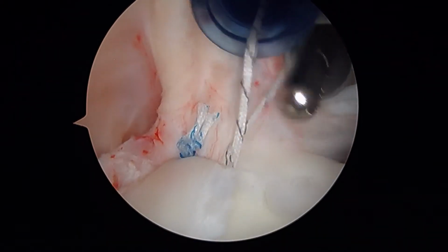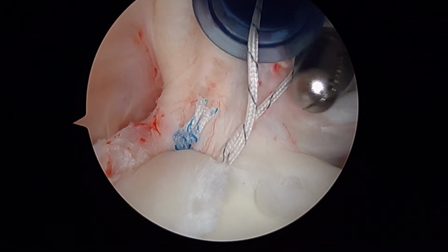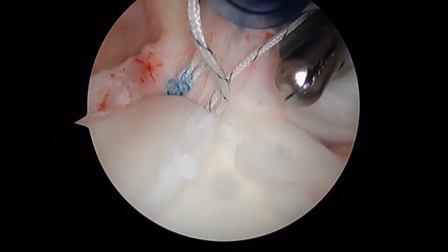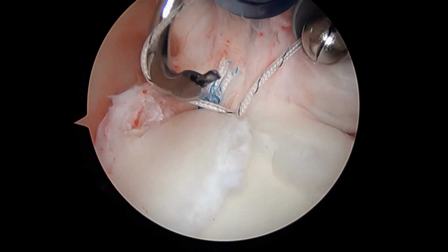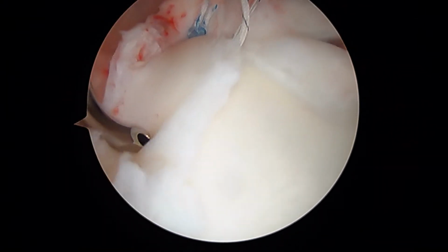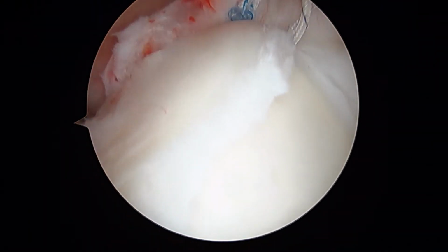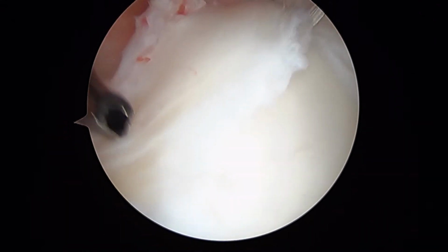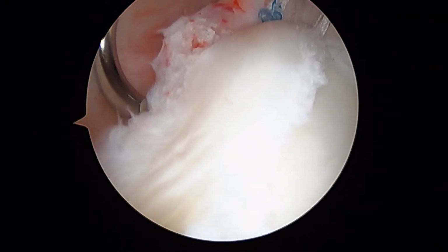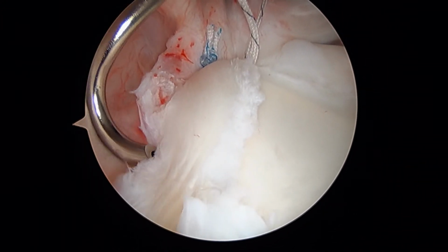Okay, so we've got the first suture passed. Since we used a larger anchor, we've got another suture we can use here. We're going to use a slightly different angled hook to try and make a stitch right back here. You can see how this, if I can demonstrate it, is still a little bit loose. See that? So we're going to try and, two hands on this, hold right there. Okay, so we're going to try and come through right about here.